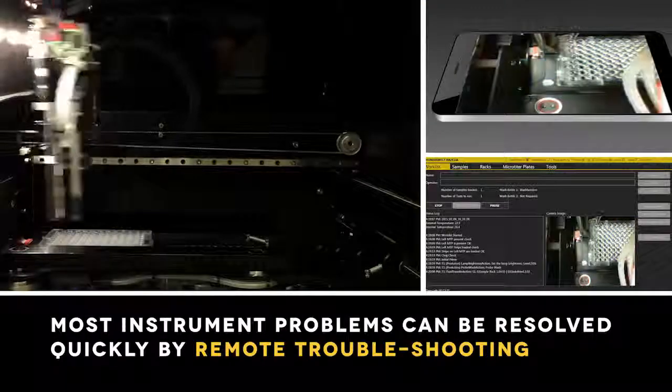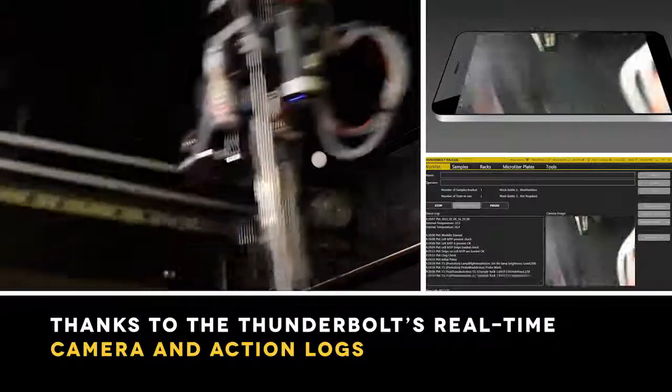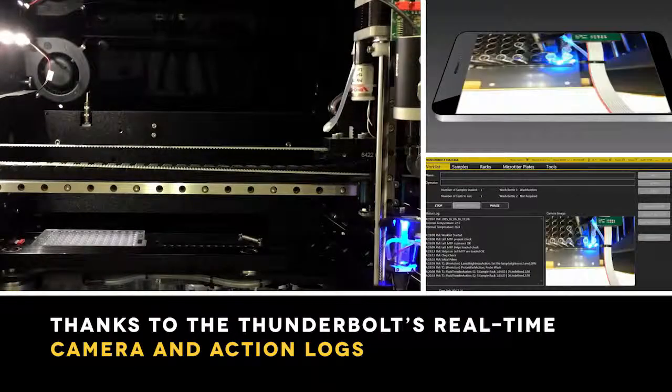Most instrument problems can be resolved quickly by remote troubleshooting, thanks to the Thunderbolt's real-time camera and action logs.